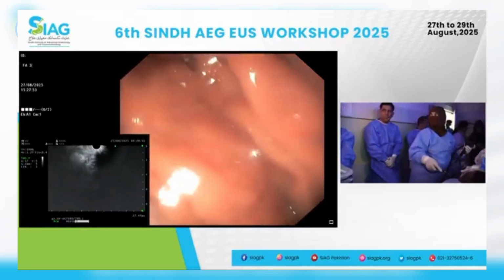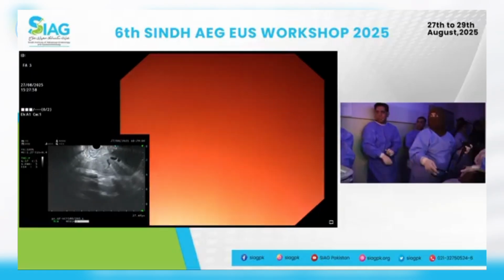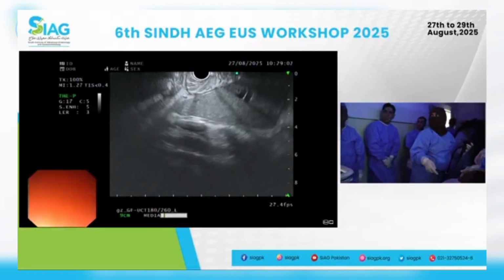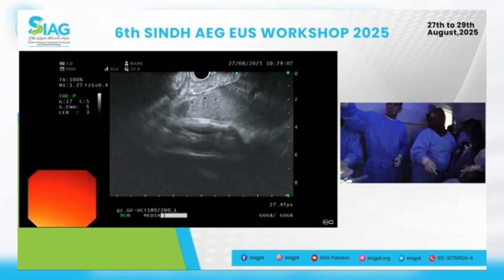One minute, wait. Good. Excellent. And now what will you do? Excellent. Good. Now give us the EUS image. Good. So let's just freeze. Freeze it. Just show me the button. Because what you want to see here is, give me the pointer also, okay?